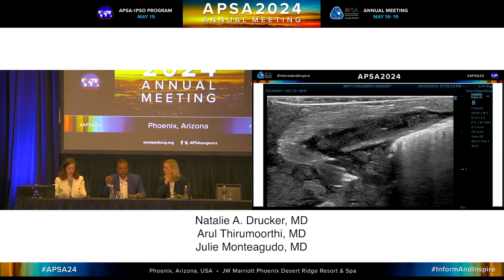The other thing I always want is, when you're looking at your needle bevel, the bevel has to be pointed towards the feet, because otherwise when your wire goes in, it's going to be directed in the direction of the bevel. So if it's pointed upwards to the head, the wire goes up to the back wall. So you really always have to be pointed to the feet.